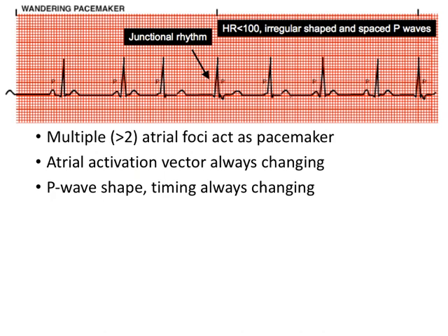Or the spacing between the T wave of a previous cycle and the P wave of a new heartbeat will always change. So you might see flattened P waves. Normally, we know they're nice, rounded bell curves almost. They might be notched. They might be biphasic, so they go up and down. They might be flattened.